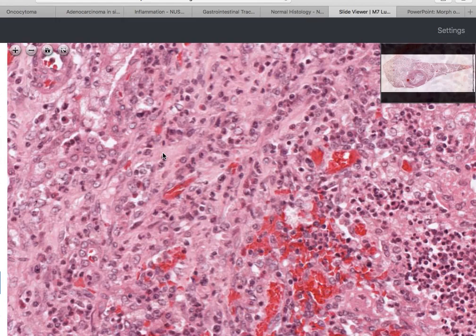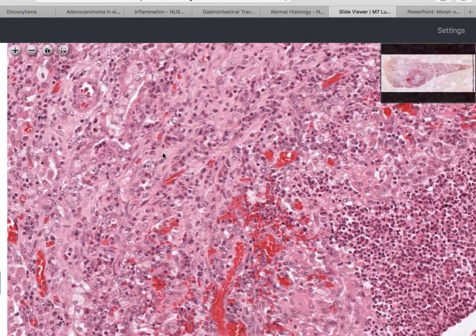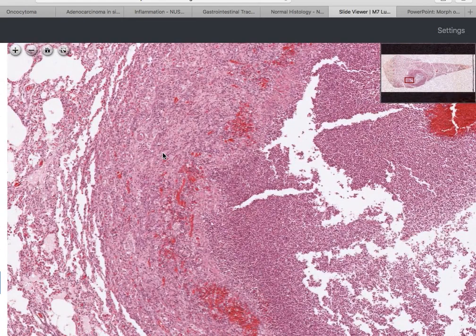So over time, whenever you have an abscess collection, typically a granulation tissue wall will develop surrounding it, and given time this will organize and become fibrotic. So that gives you a cavity. That cavity is filled with the abscess collection.